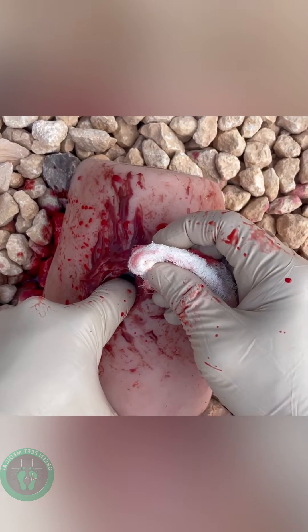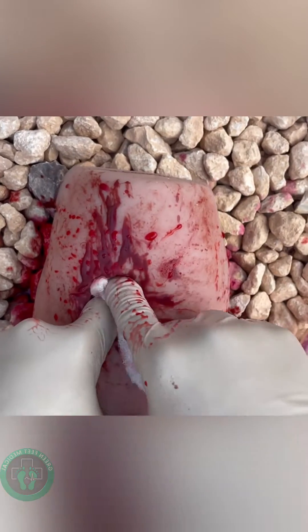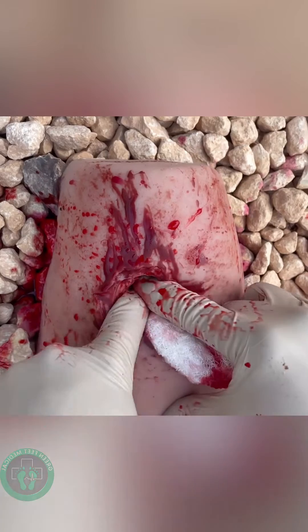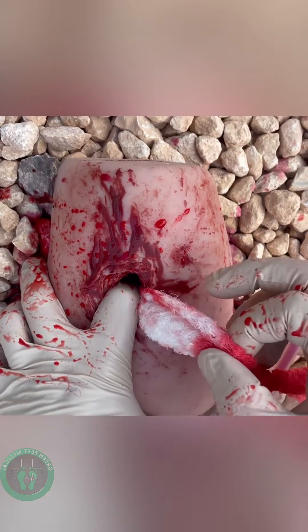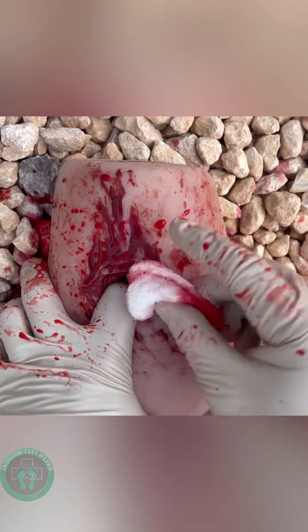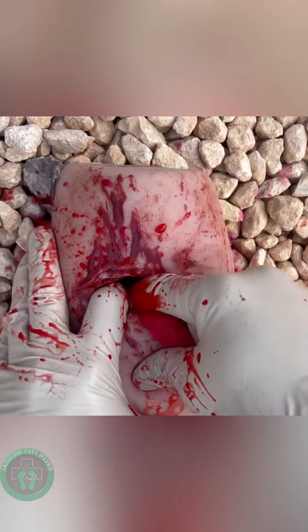Once I do this, I don't want to take pressure off the artery once I've found it. So I'm going to take my power ball, push it over the top of my finger into the wound cavity onto the source of the bleed, and hold it right there — keeping constant directional pressure against the artery towards the bone. Simply push and replace methodically.